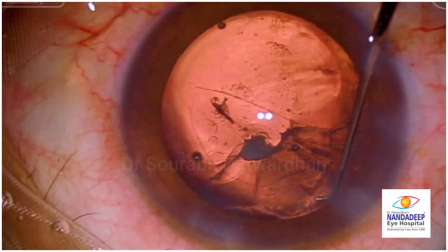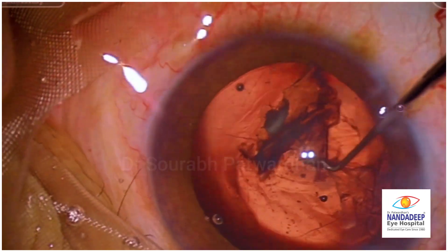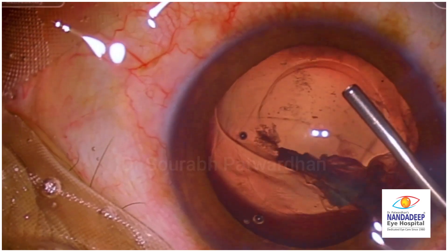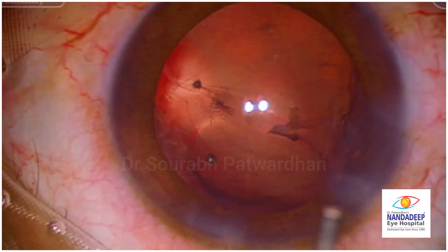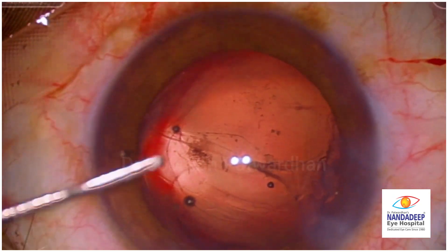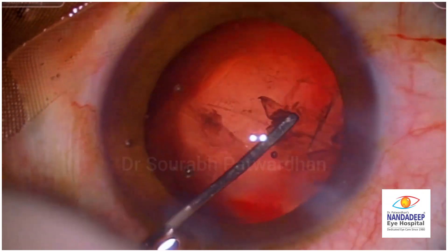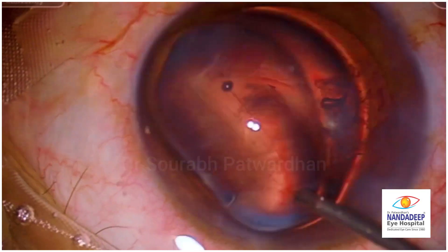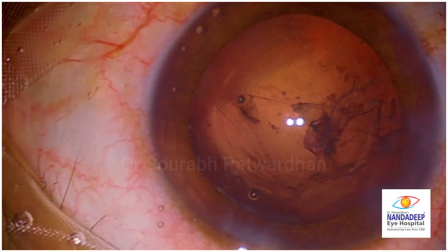Now you can see that half of the epinucleus is out, and in the sub-incisional area there is still some epinucleus. Now you can clearly see the PC tear, which was pre-existing. I am going to dislodge this sub-incisional epinucleus using Sinskey, and then carefully with use of VISCO I have taken it out. While doing that you could see that the tear probably extended a little bit because I pressurized the chamber while removing this epinucleus matter using VISCO.